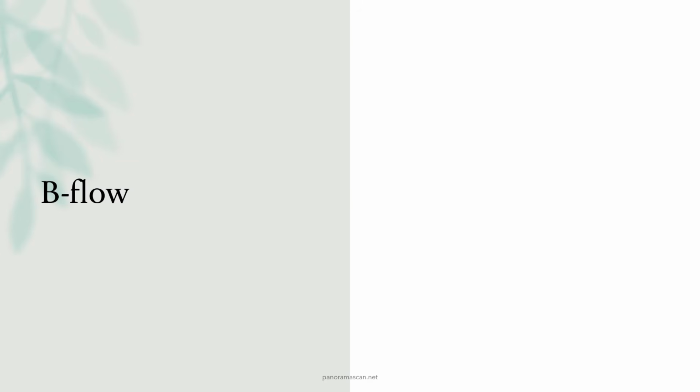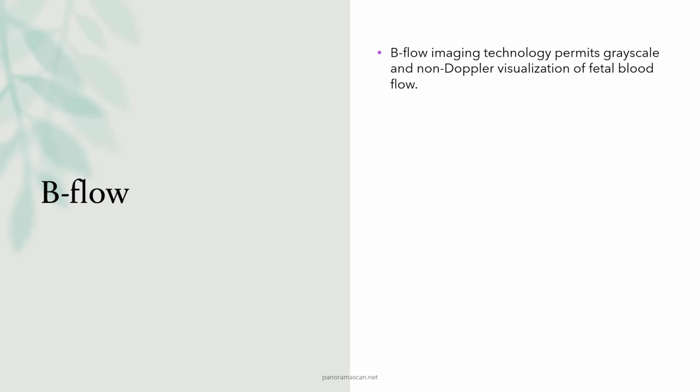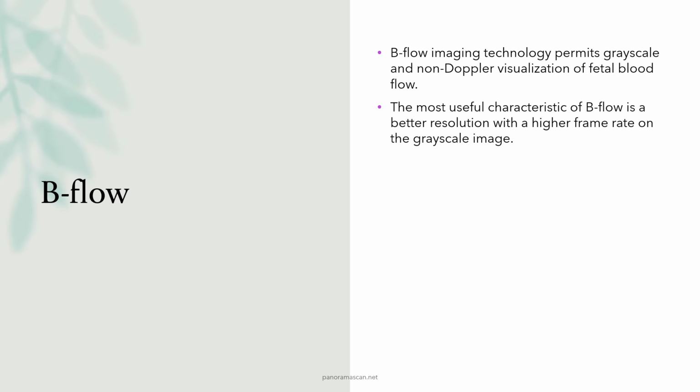B-flow imaging is a powerful tool for fetal blood flow visualization, providing enhanced resolution and clear, grayscale images that help in the evaluation of peripheral blood vessels. Unlike Doppler imaging, B-flow allows for the direct visualization of blood reflectors without requiring adjustments for flow velocity or PRF, making it a simpler and faster option for clinicians.